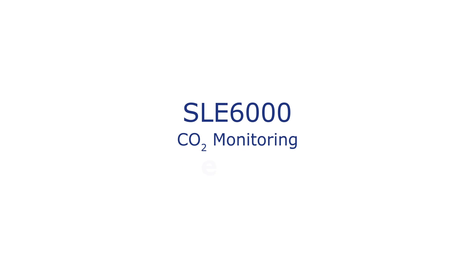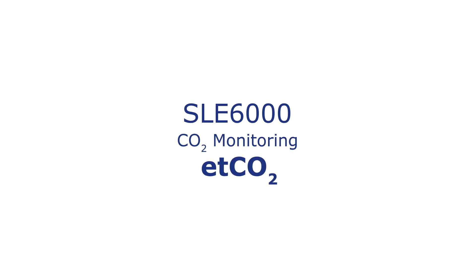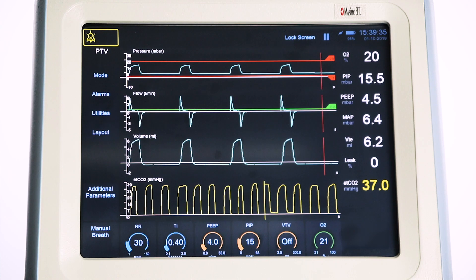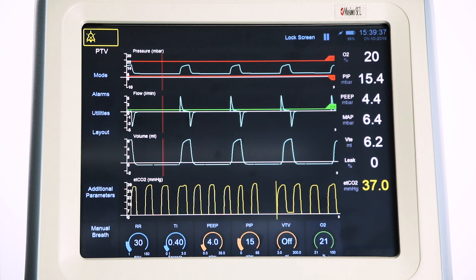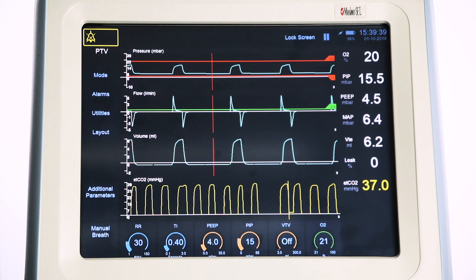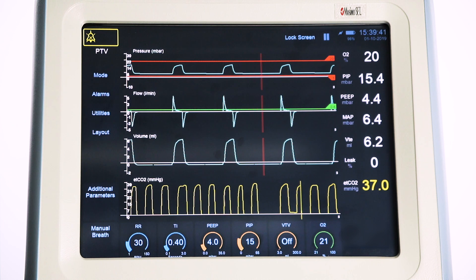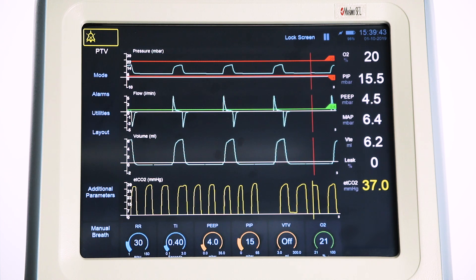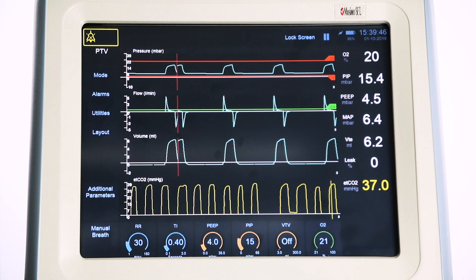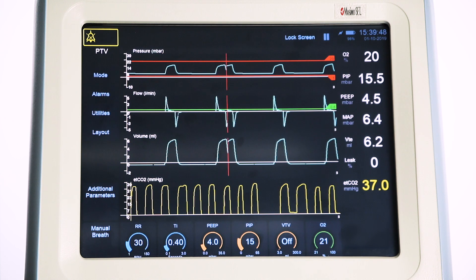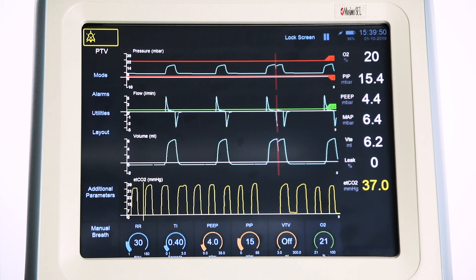CO2 monitoring on the SLE6000. The SLE6000 has the facility to measure a patient's end tidal CO2 using an external capnography module. This can determine the CO2 levels in the exhaled breath of both intubated infant and neonatal patients.